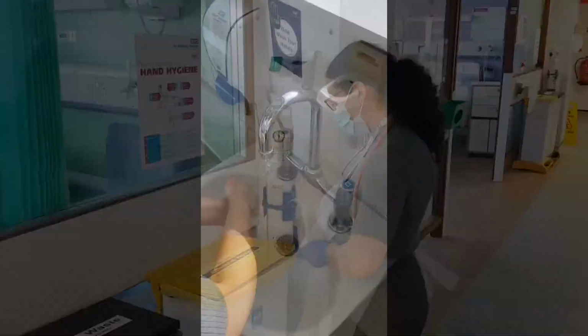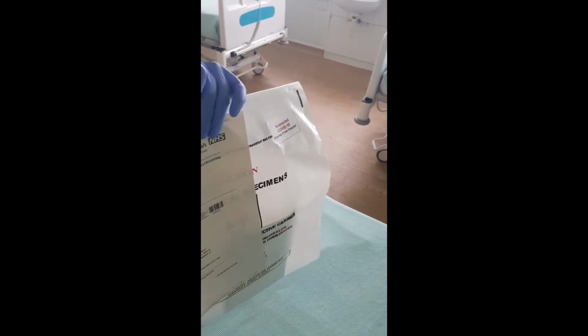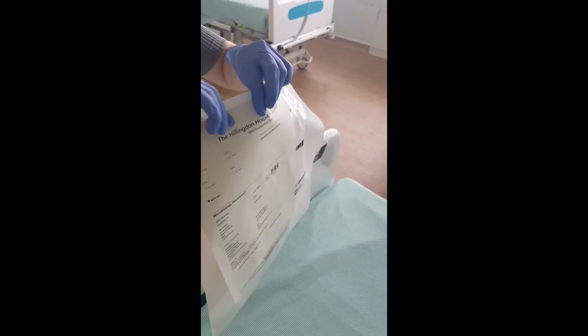Remove all PPE and clean your hands. Stick the request form on the front of the white bag. Call the porters or carry the bag to pathology reception for further processing.